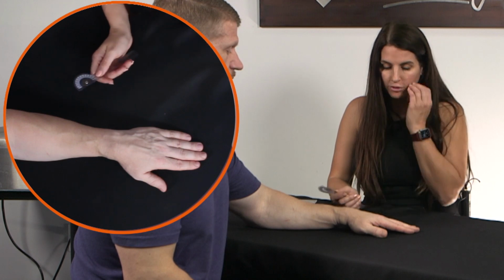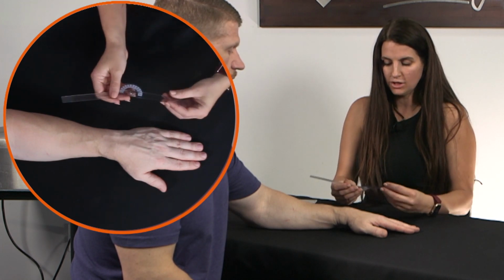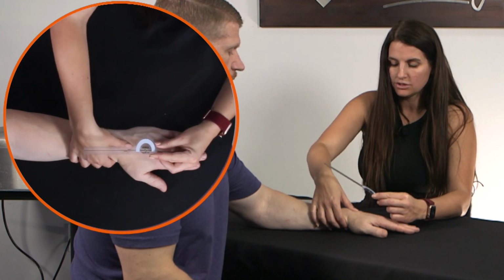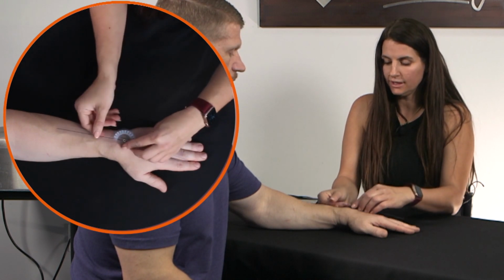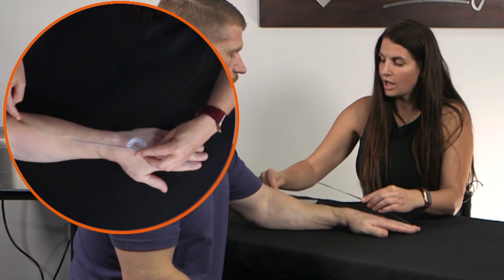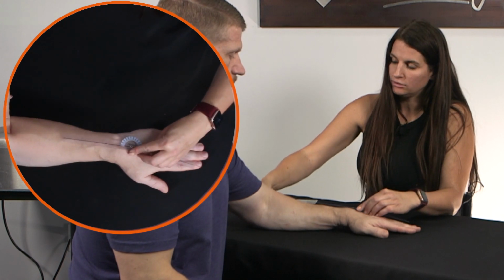Now I'll show you how to perform radial and ulnar deviation. The stationary arm, you're going to line up at, it's usually right at that capitate. You want the anchor to be, I'll put this up so you guys can see it. And this goes right down the line. You want it to line up right up here at that lateral epicondyle.